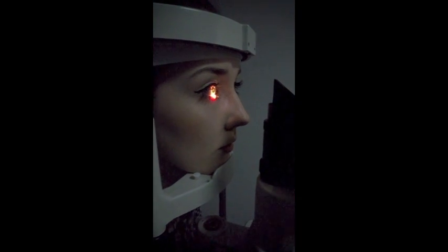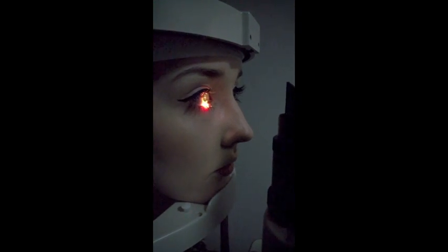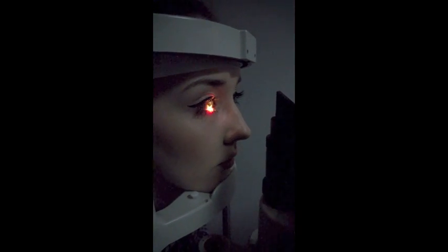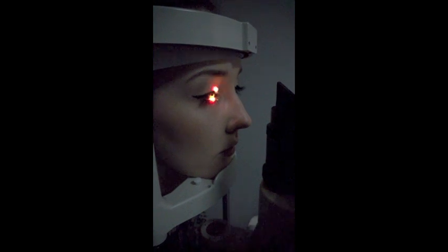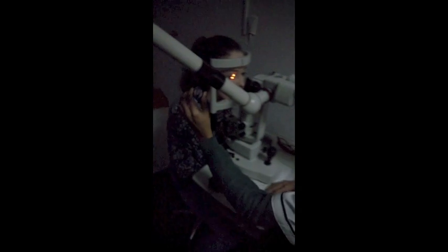A long slit of about 2 mm width should then be focused on the centre of the cornea, so that the light passes directly through the pupil centre. The procedure should be carried out at low magnification, 10 to 15 times. You can now introduce the lens.